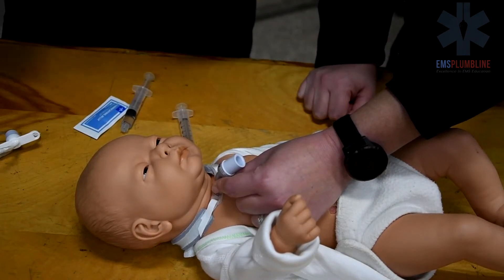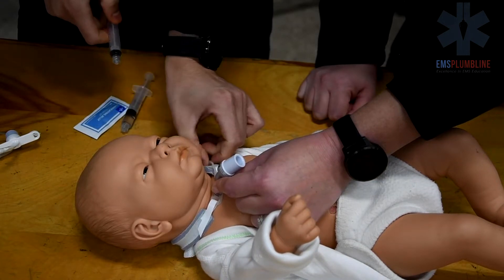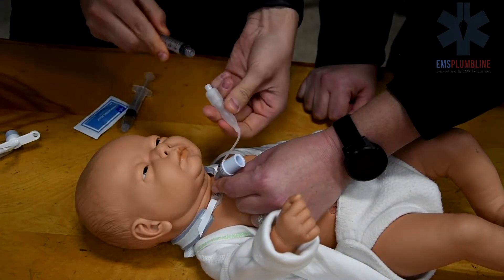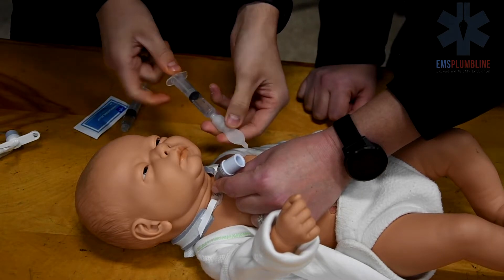In the event the obturator is missing, a stylet can be used as a guide to place the trach tube. Perform a trach change as per normal procedure, utilizing two people. One person will maintain the trach tube in place.